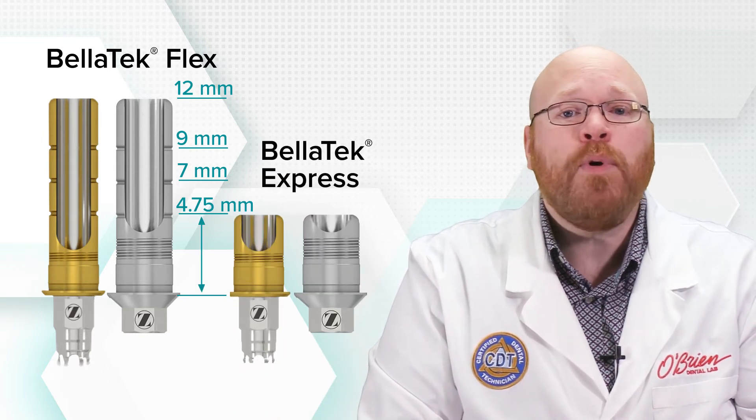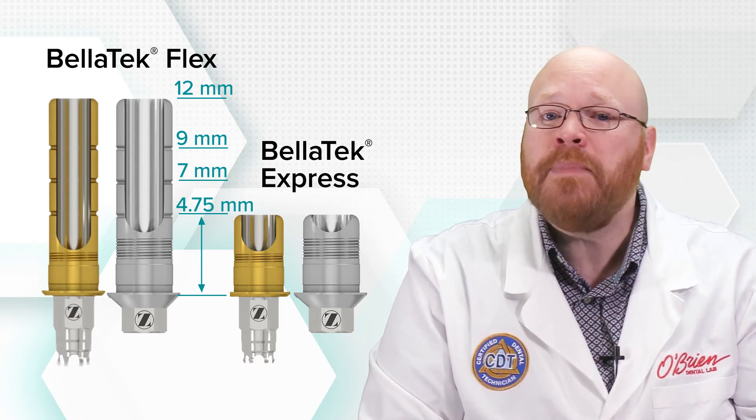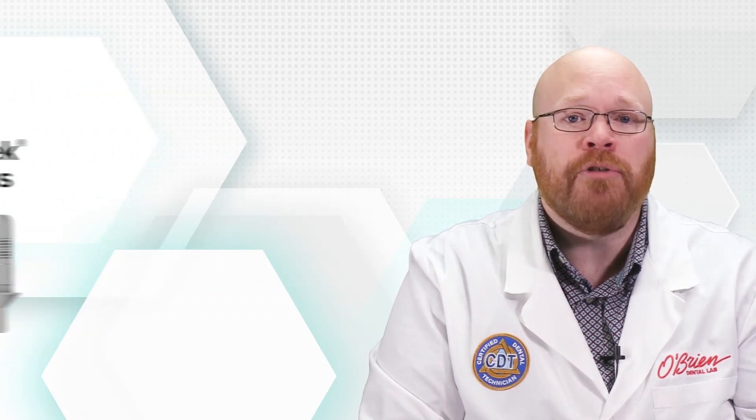The Bellatec Express is a 4.75 millimeter tall abutment, which has the same dimensions as the Flex abutment that has been cut down to the 4.75 millimeter groove.